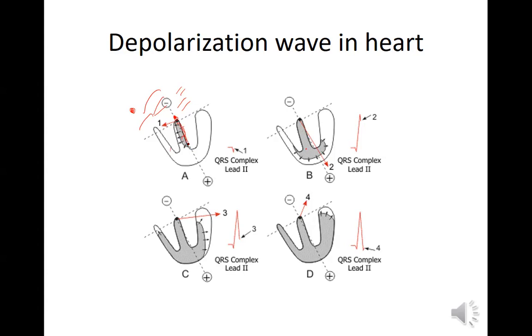Transmural means through the whole wall. And of course, that's more damaging. But this is pretty cool. One thing about this I like, it shows you that at this point in depolarization, it hasn't reached this thickness yet. So you might get that little negative Q wave there. And you don't have to have a Q wave at all for it to be normal. Like I mentioned before, if it's excessive size amplitude of a Q wave, that could signify an old myocardial infarction, possible scar tissue.